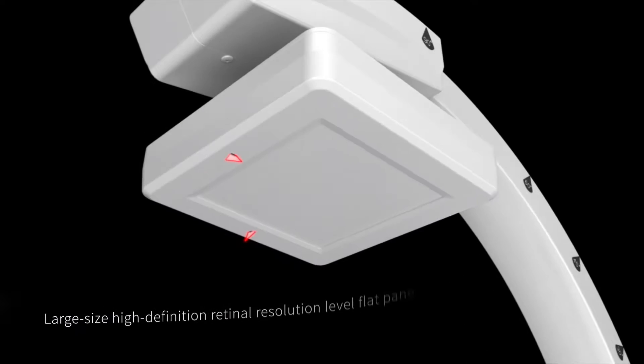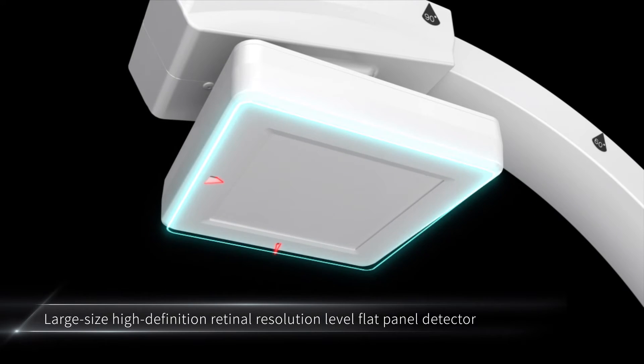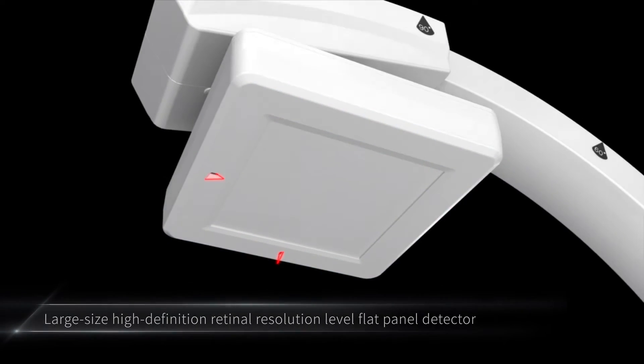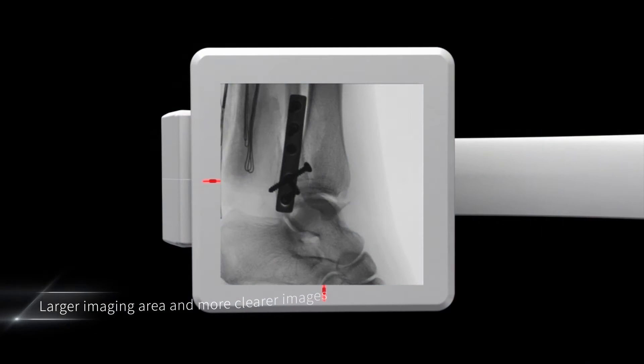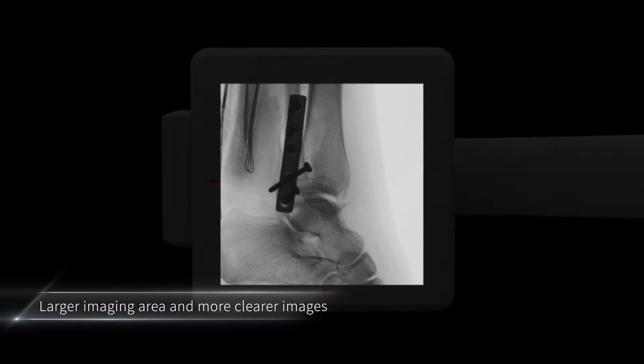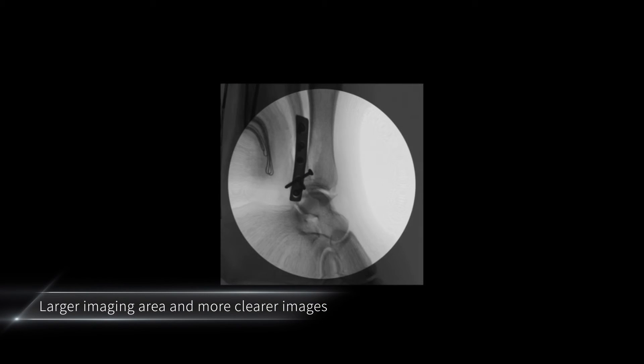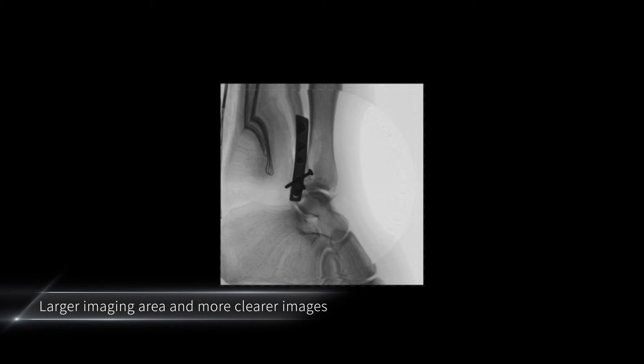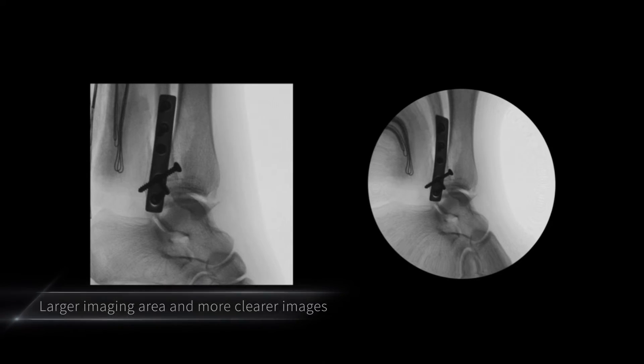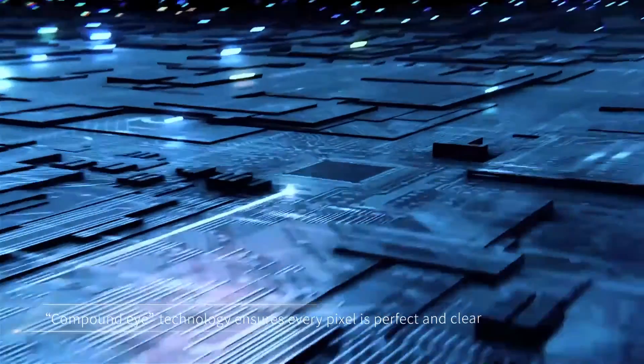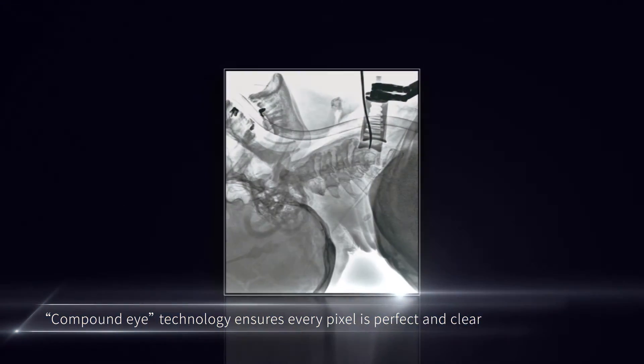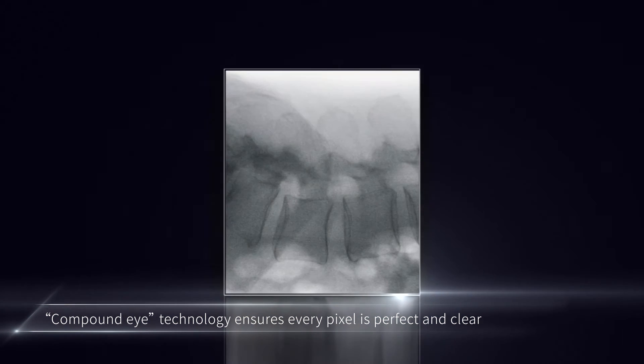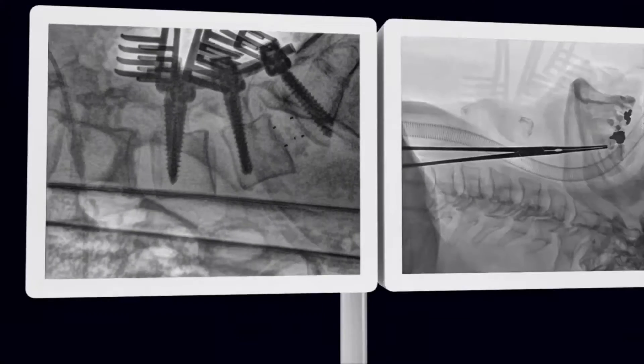High-definition dynamic flat-panel detector has super retina resolution in high-definition image acquisition. Compared with intensifier, flat-panel detector has a larger imaging area, eliminating optical distortion interference in undistorted images. Bionic Compound Eye Image Processing Technology ensures every pixel of image is perfect and clear, restores lesions and presents tissue details in high-definition.